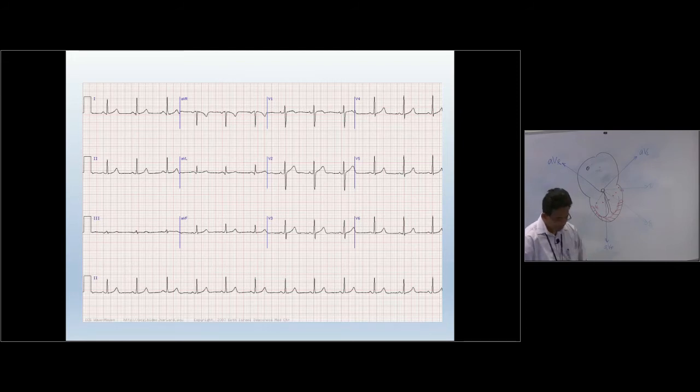When it comes to ECG interpretation, rather than trying to analyze each and every lead, we group lead combinations and try to identify which leads are looking at what surface. So if you think the patient has an inferior infarction, the patient should show significant changes on the inferior leads. Now we know the inferior leads are lead 2, 3 and AVF.